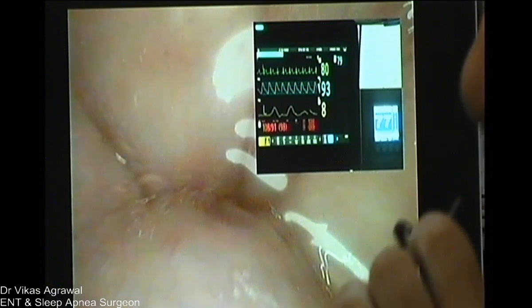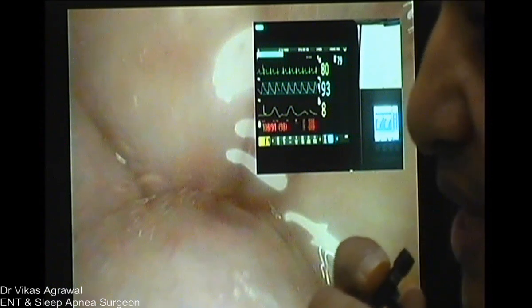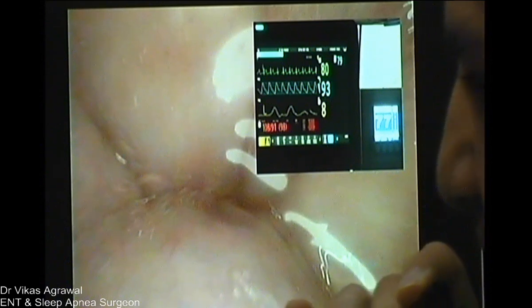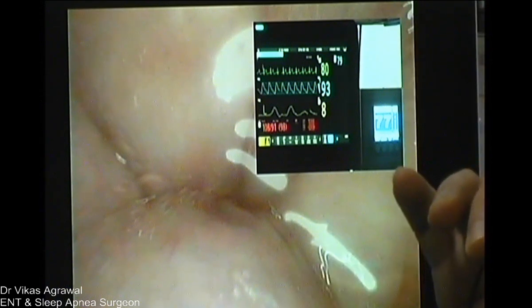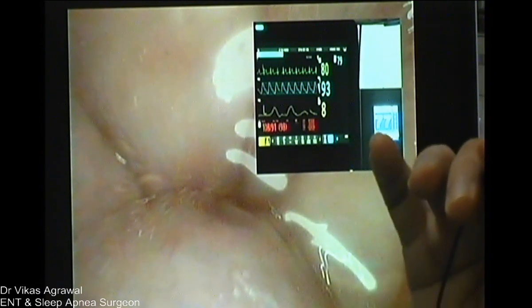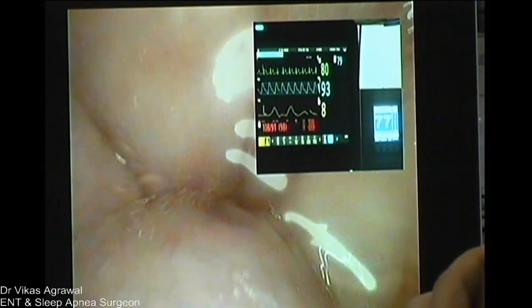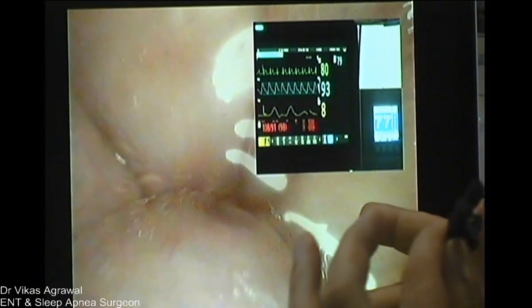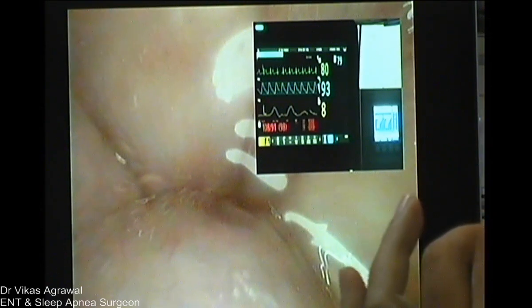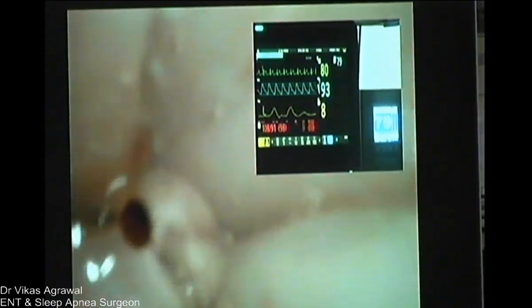Yeah, so it's absolutely a great idea to give a slit, and that's the reason I did not try to prevent a septal tear in this patient where there was a gross spur. So if there is a small septal tear, it is anyway good so that the blood will drain out. Only thing is that you should not give the tear on the same place, at the same level, to prevent a septal perforation from happening. That's a very, very great idea. Anyway, we have packed the nose here, so there is no question of septal hematoma. And upper part septal hematoma we have already prevented by putting the gel foam. So let's come back to our next DISE. Now see this, what is happening here?